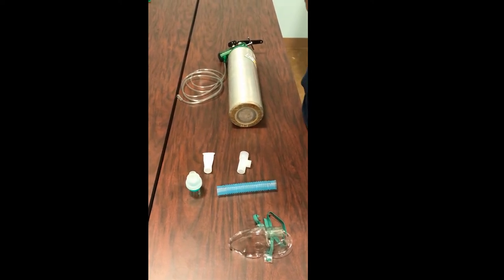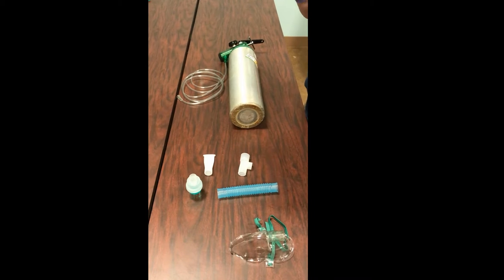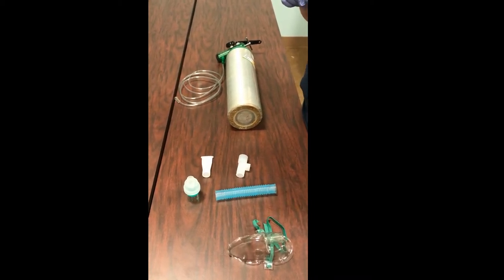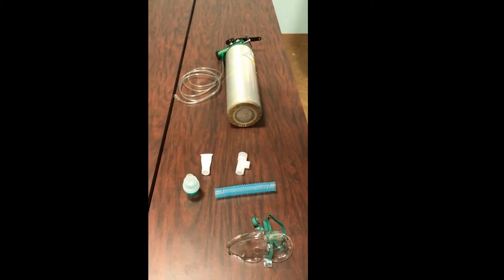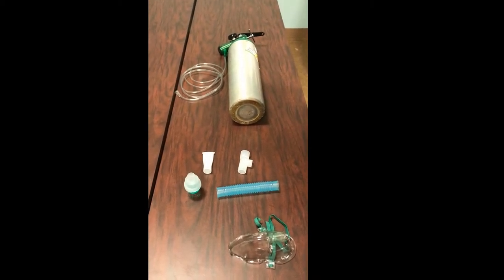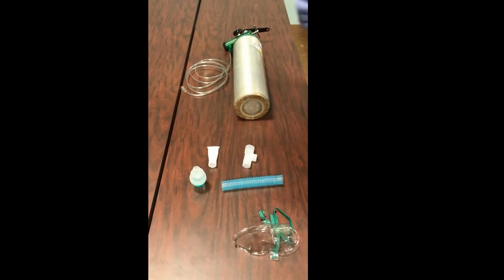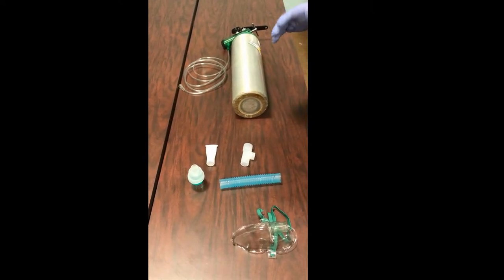What albuterol does is relax that smooth muscle that is now constricted and narrowing the airway passages. So what we're doing is trying to get this medication into the patient, and by giving it through a nebulizer, we're going to use oxygen to help aerosolize it.